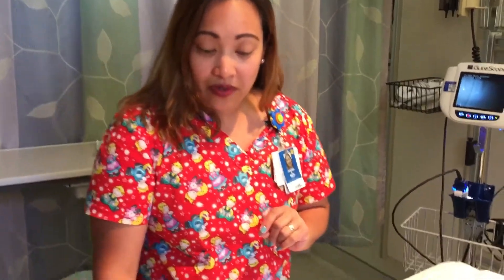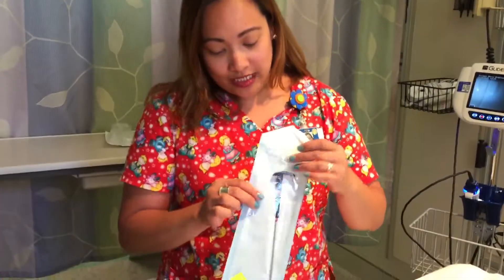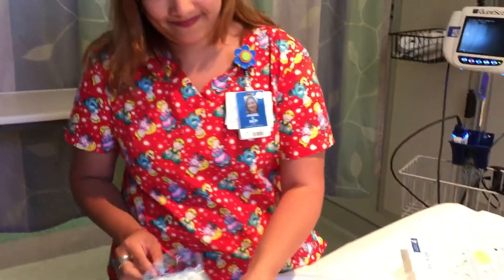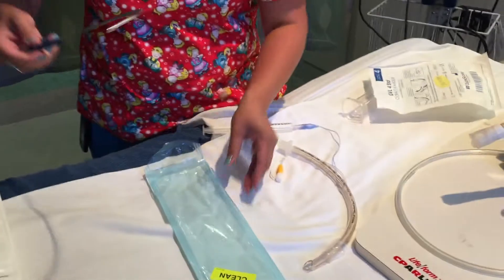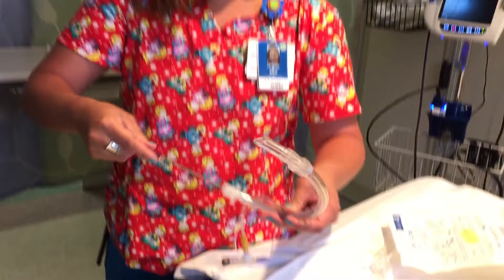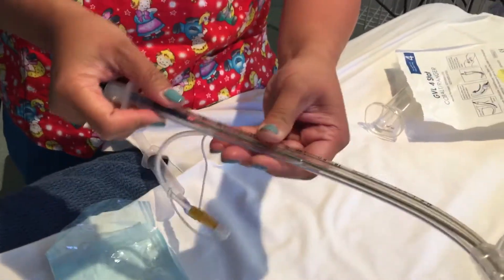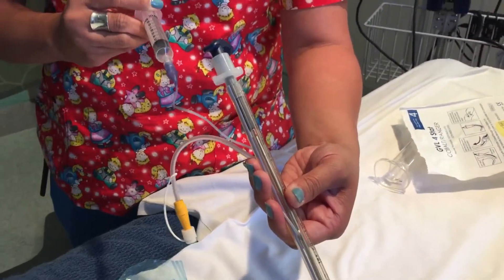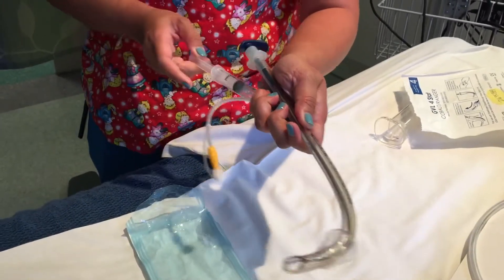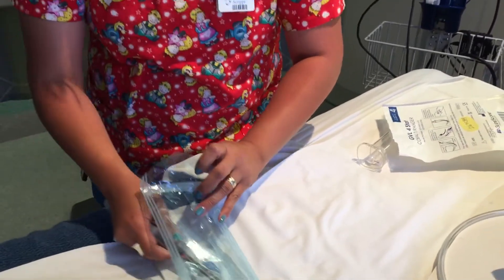Now let's proceed to the preparation of equipment for intubation. We will grab our stylet — as you can see, this stylet is specially made for the GlideScope. This is non-disposable, and after use we need to make sure that we're going to send it to the sterile processing department. Now let's take it out from the package and insert it into your ET tube, all the way in. Make sure that we have a nice cuff pressure for your ET tube. Put it back in the package, ready for use.